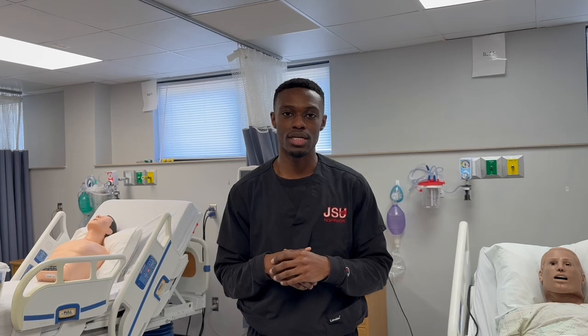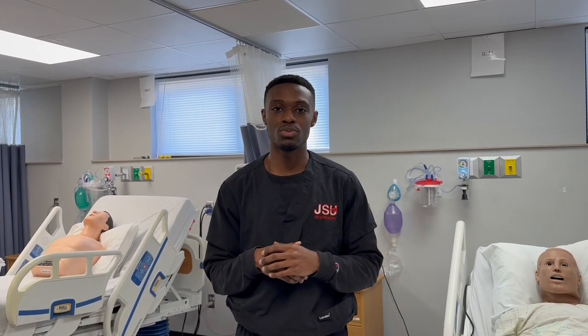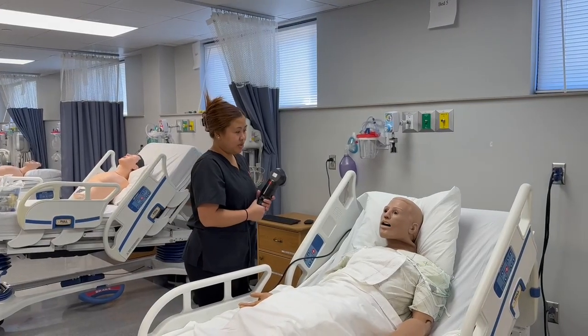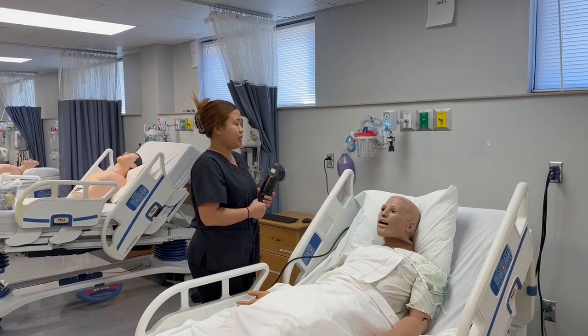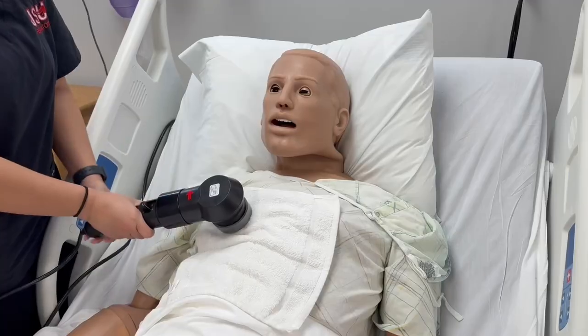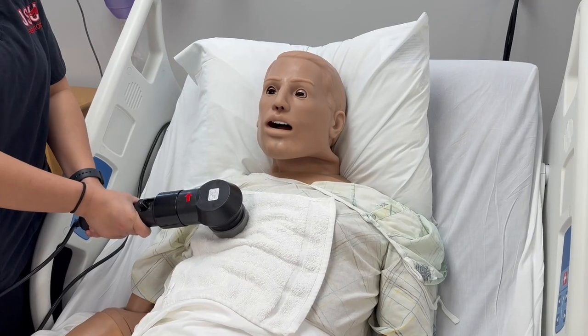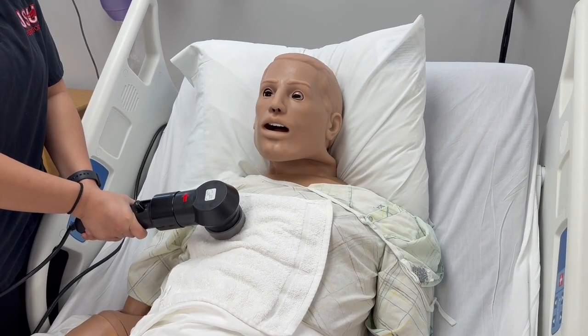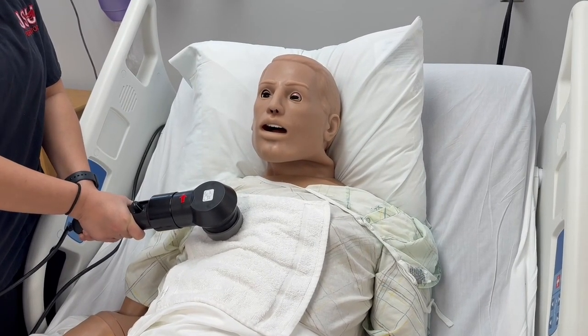One of the ways we use bronchohygiene therapy in the hospital setting is CPT. One of the main devices we'll use on our patient is the percussor. As Roshi is demonstrating with the device on Mr. Smith, the main use of this device is to mobilize lower lobe secretions in the patient.